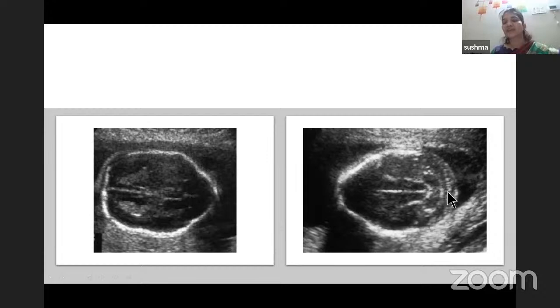So the cisterna magna is obliterated, and the cerebellum has this pull-down effect, and that is the reason we get the banana sign. Because of that pulling down effect, intracranial contents have negative pressure, and because of that we get this frontal scalloping that we can see here. This is called the lemon sign and this is called the banana sign, and we have our banana here.